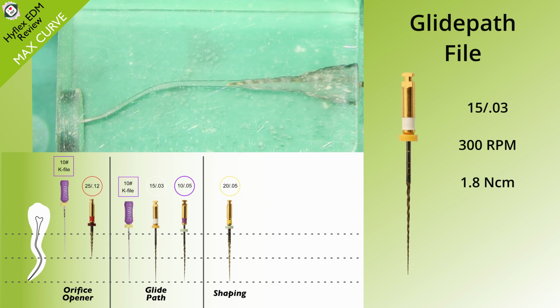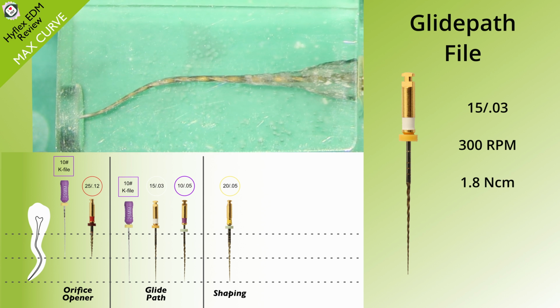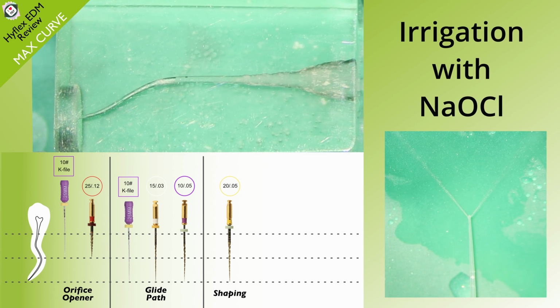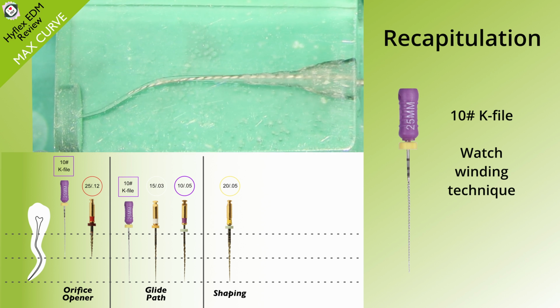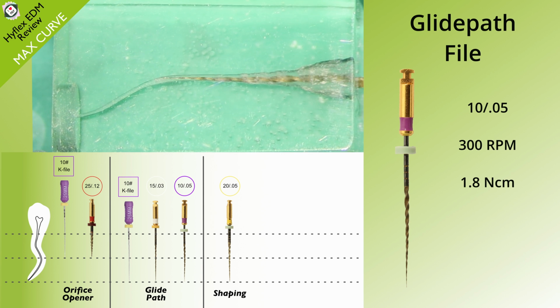And this is where we use the size 15.03 Glidepath file, not the 10. The 10 is a size 10.05 taper, and that is the significant difference here. It's not so much the tip size that is significant, but the taper. It's actually the coronal third which will stop you getting to length. So if you have quite a wide taper, then this is going to stop you from getting to length. And again, this is why they use the size 15 over the size 10, because the 10's got the larger taper.